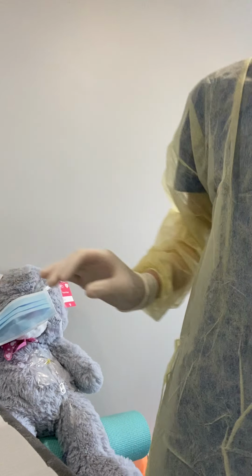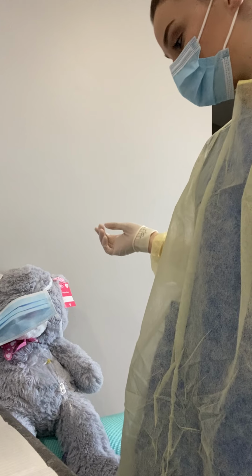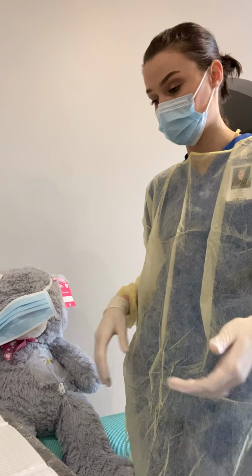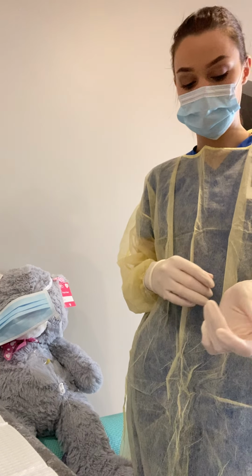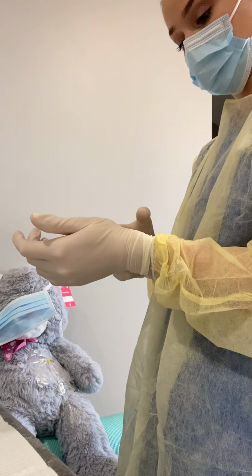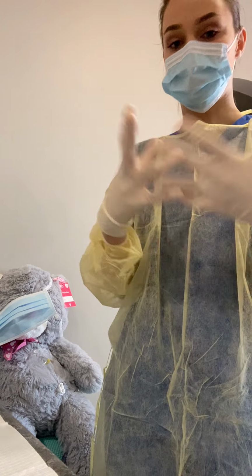Okay, so now I have got the order that she's good to go. She needs to go home, so I'm going to go ahead and de-access her port. So what I'll do is I'll have clean gloves on. So we can just say these are clean. So these are clean gloves.